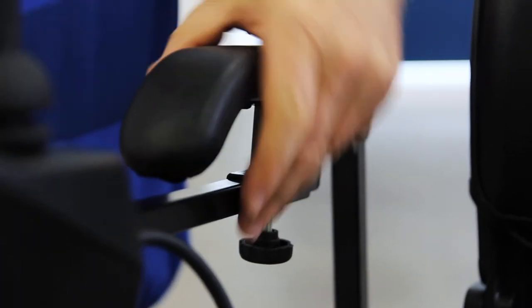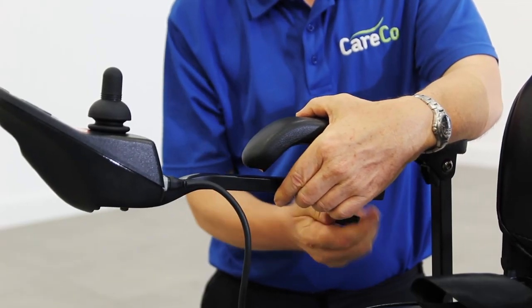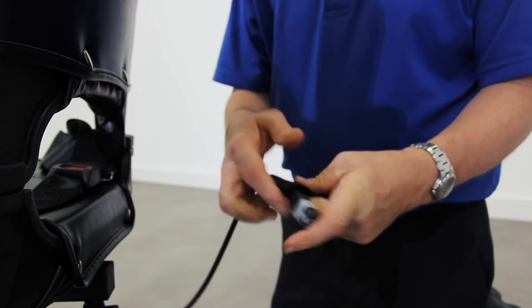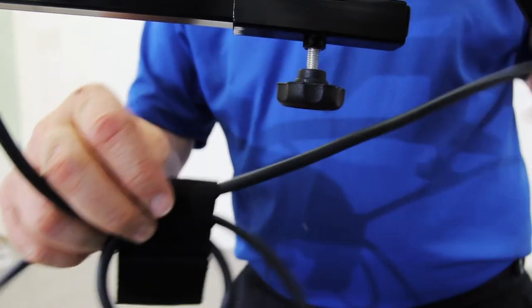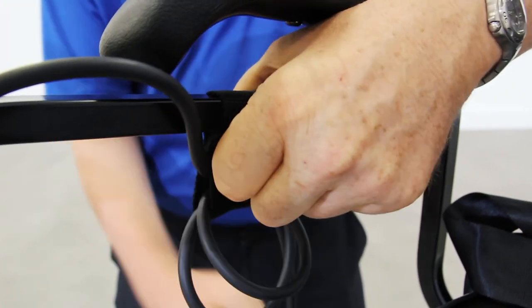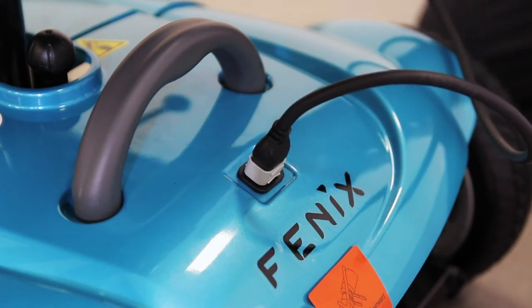To attach the joystick controller, first you must slot it in through the metal grooves under the right armrest, then secure it with the knob. To reduce the slack on the cable, loop the loose cable around the velcro strap three times, then attach the strap to the metal frame of the controller. Finally, plug the cable in at the back to connect the controller to the motor.